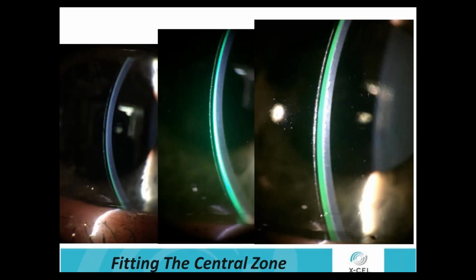All right, here's some examples of the differences in clearance. You can see here, a little difficult to see, the thickness of the lens and barely any clearance there. And then as we move to the right, you can see we're building that. So all we did here is we went to a steeper lens, or more of a corneal sag, central sag lens as we're moving up. You can see inadequate clearance, probably pretty adequate centrally. And look at the inferior again. We have a lot of clearance down here.